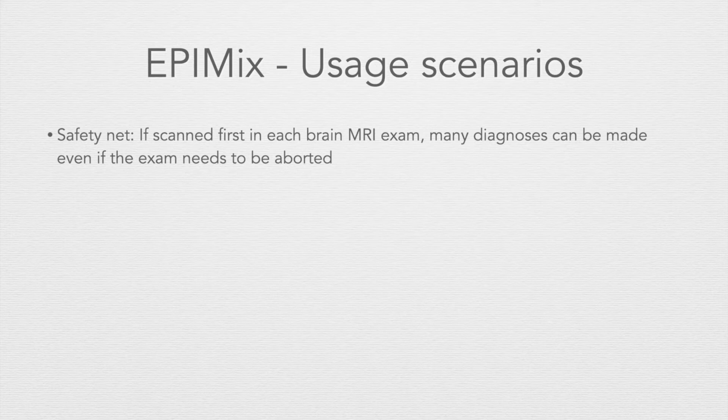Sometimes the only images that have been scanned and have been good are the EPIMix ones. Sometimes we have been able to scan conventional MRI, at least in part, and they have been too destroyed due to motion artifacts. So then they have to resort to the EPIMix data.